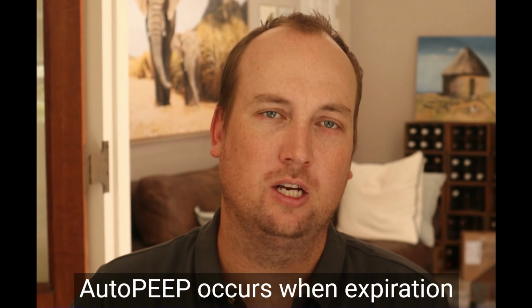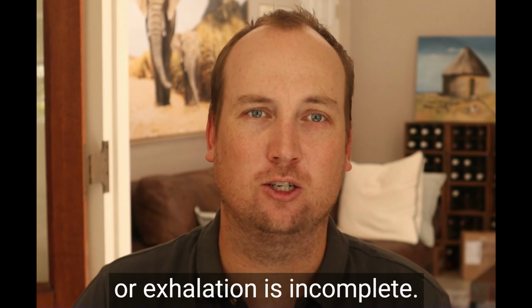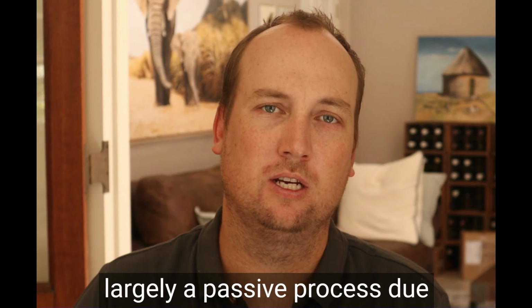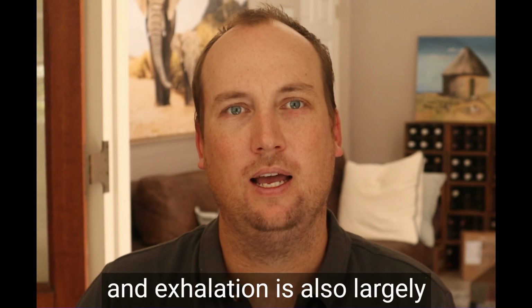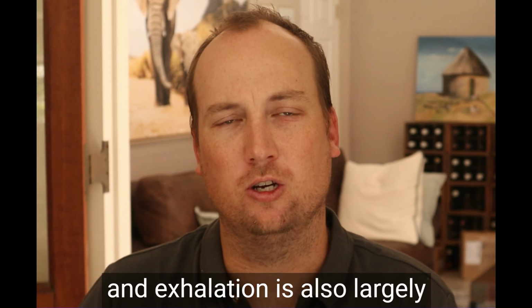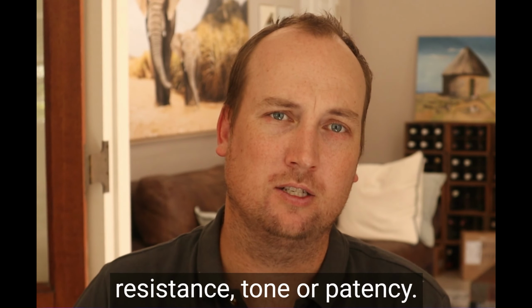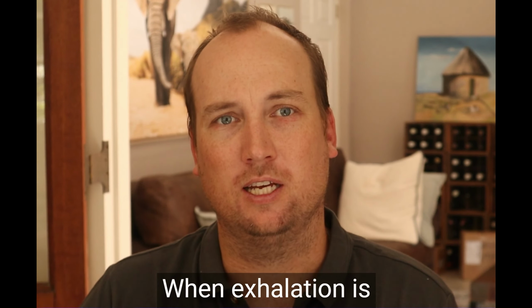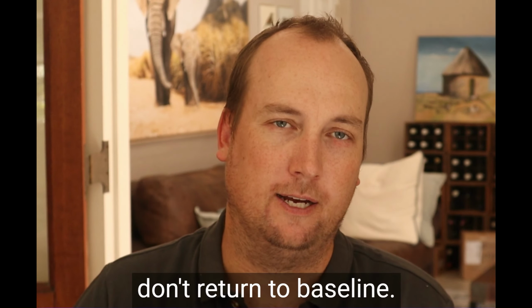Auto-PEEP occurs when expiration or exhalation is incomplete. Remember that exhalation is largely a passive process due to muscle and elastic recoil, and exhalation is also largely dependent on the small airway resistance, tone or patency. When exhalation is incomplete, the lung volumes don't return to baseline.